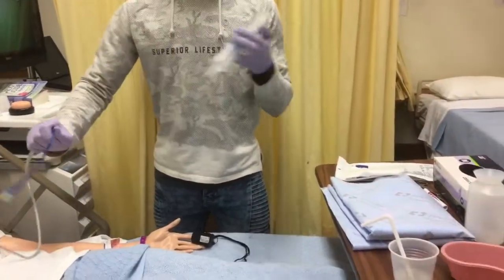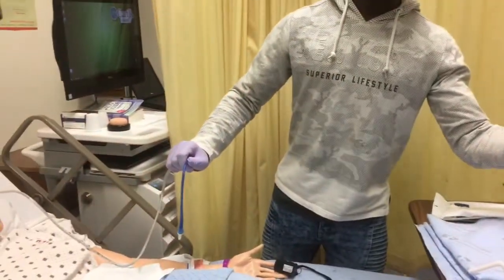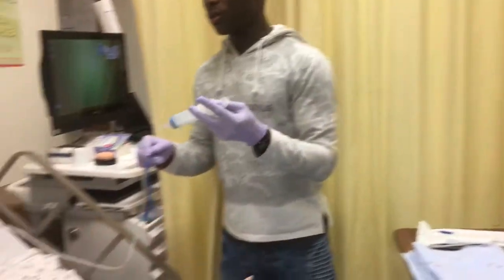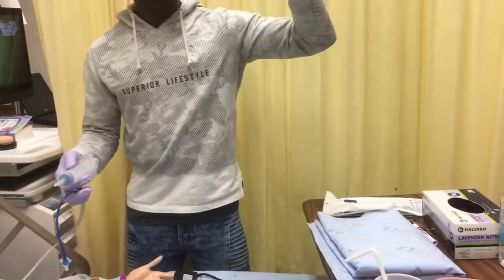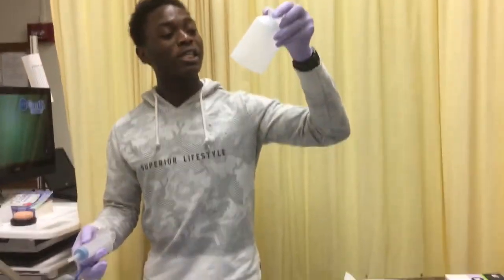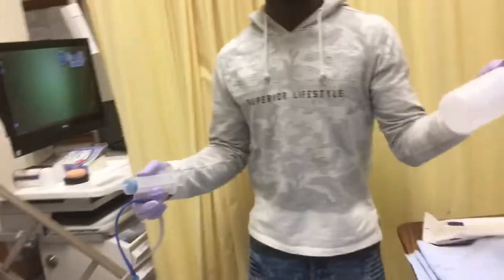So you want to do this continuously until there is no more food content that can come out. And once you're done with that, you want to measure how many milliliters are in here. And here my patient has only 100 milliliters out of 300 milliliters. It means that my patient is digesting the food properly.